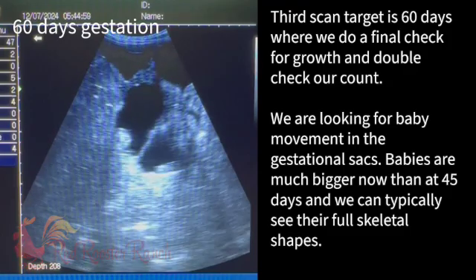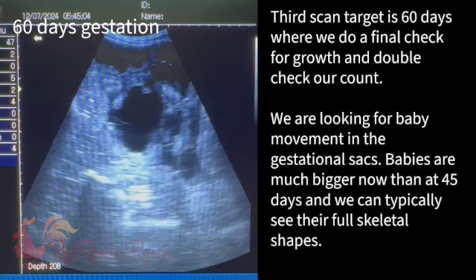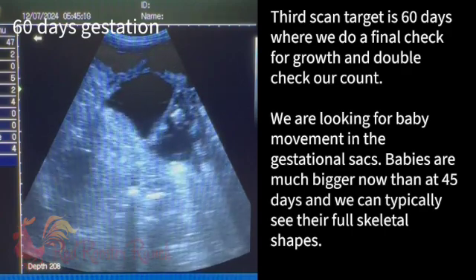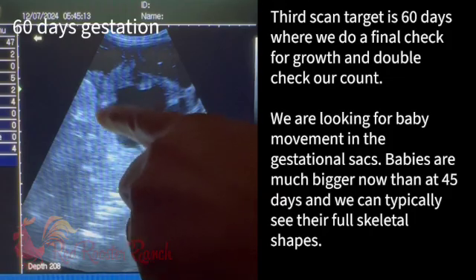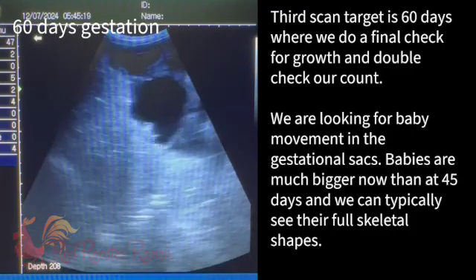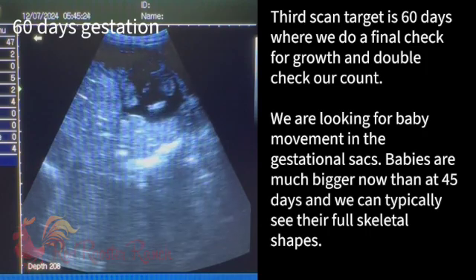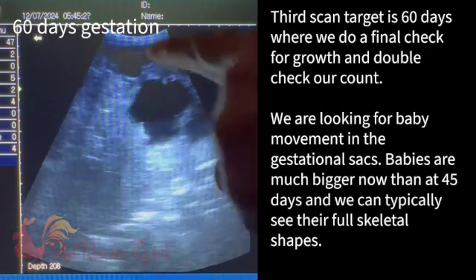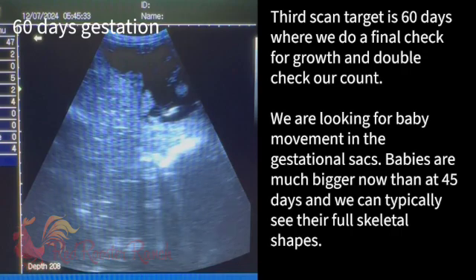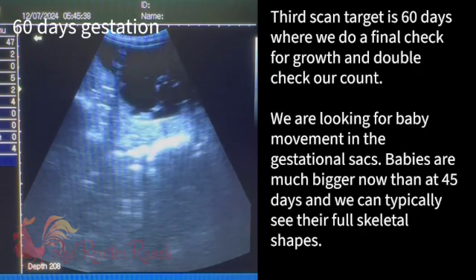I think she has four. I think you and your sister are both going to have four. That could be just placental nodes in that sack. Let's spend a little time seeing if we can get a better look. Nope — that's a baby. That's a baby, unless that's this baby in this same sack. It's possible. That's just one baby — yep, there we go. You can see it better from this angle.